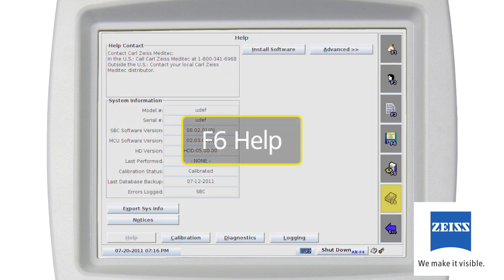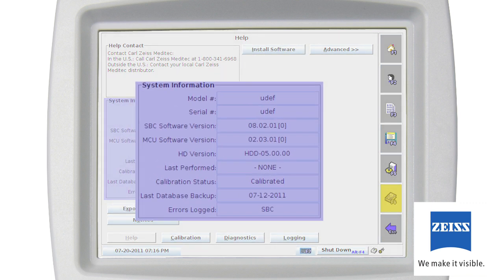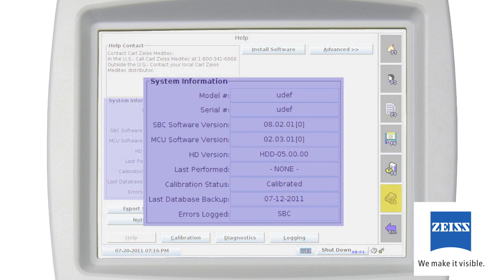The Help screen, F6, provides basic system information regarding the Humphrey Matrix instrument with buttons to access user information, instrument diagnostics, calibration, logging, and software installation. System information includes instrument model and serial numbers, software version numbers, calibration information, last database backup date, and error log status.